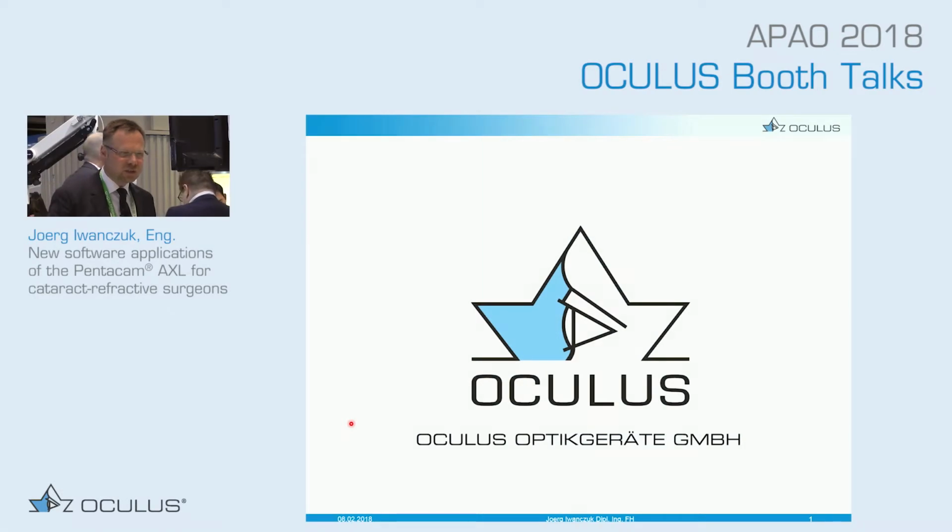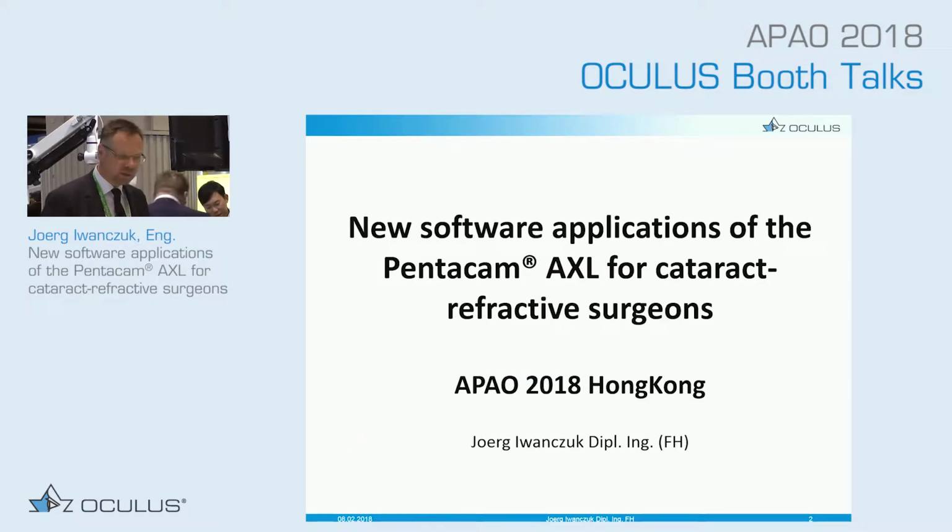So welcome to this lecture about the Pentacam AXL. I want to talk about some new applications of the software, especially for cataract surgeons. My name is Joerg Iwanczuk. I am product manager for the Pentacam and I am based in Germany.